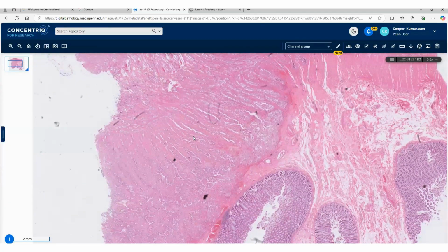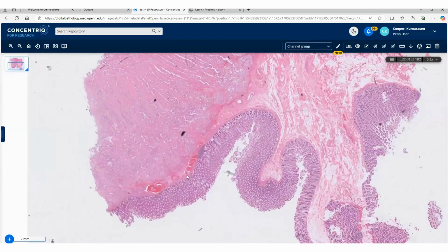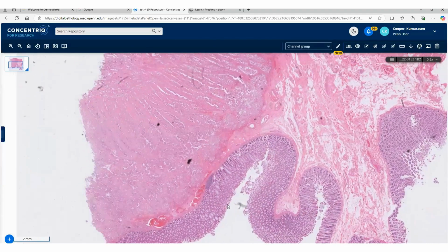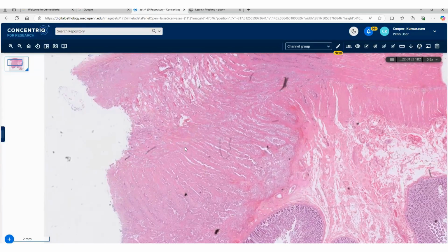So let's start with this. This is the first case I chose for you today, which is a 57-year-old female. And you can all recognize that this is bowel mucosa, colon mucosa. Just to go back to low power, you can see a tumor literally occupying the submucosa and the muscularis propria all the way up to the serosa. I'm hoping you can see my arrow, which outlines the tumor itself. The epicenter seems to be somewhere between the submucosa and the muscularis propria, so we'll assume that it's in that area.